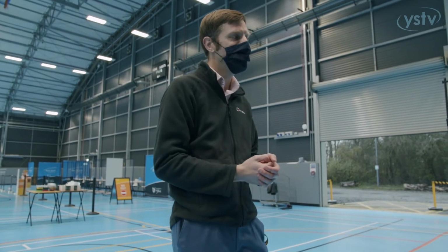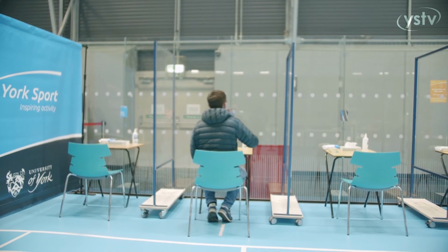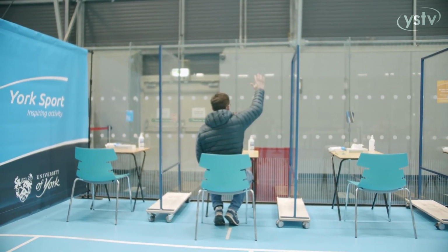You've got a mirror here, and I'm afraid this is the bit that's slightly uncomfortable, just like any other COVID swab if you've done one before. Back of the throat first, and then up your nose, just to get the proper sample there. And at that point, that's it, you're done. Signal to the test supervisor that you're all set. They'll check that everything's been done properly.